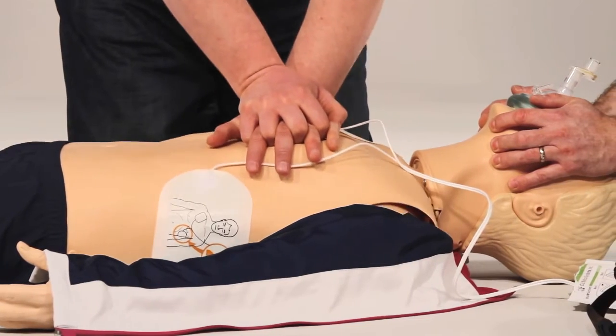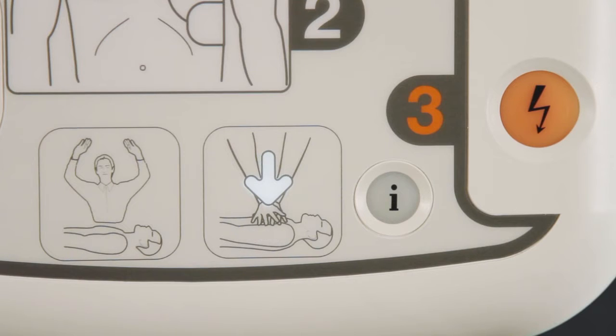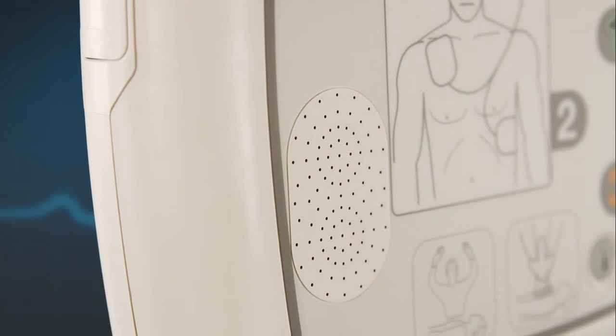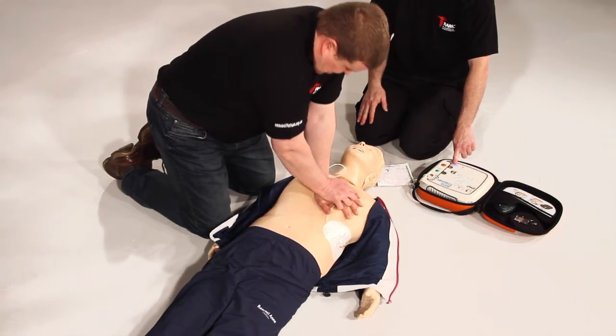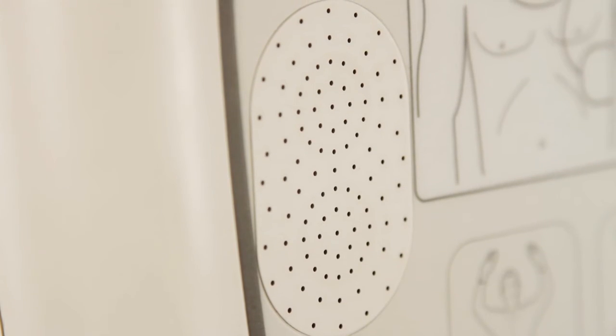If the patient is showing no signs of life, you should immediately start CPR. The AED will ask for help with CPR — press the flashing blue I button. This AED features a unique built-in ambient noise detector that will automatically adjust the volume of the AED depending on surrounding noise, to a maximum of 90 decibels. This is particularly useful in noisy environments.